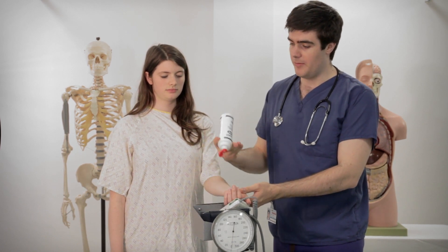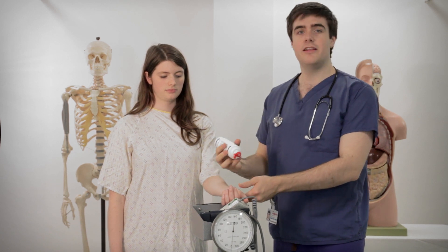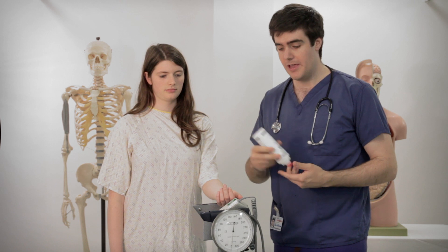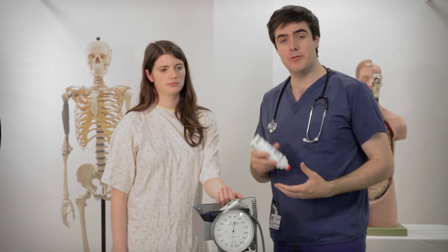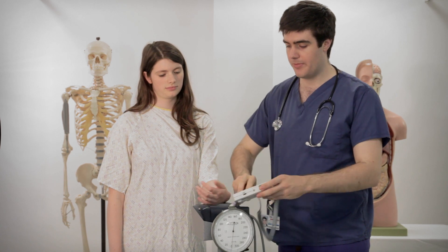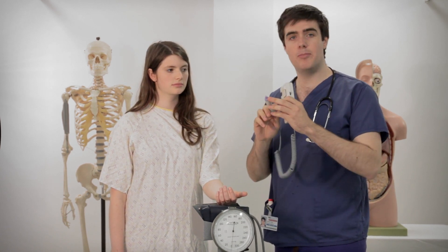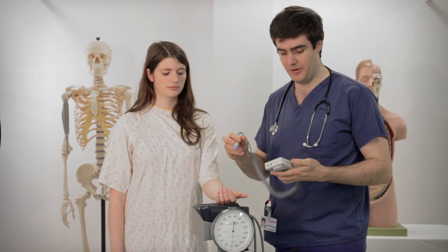First thing we need to do is put a little bit of ultrasound gel on. This ultrasound works in exactly the same way as baby scans which you might be familiar with — in a pregnant abdomen you'd put some ultrasound gel on but use a slightly larger probe. This one looks a lot like a pen and that's because it's made for picking up blood vessels throughout the body.